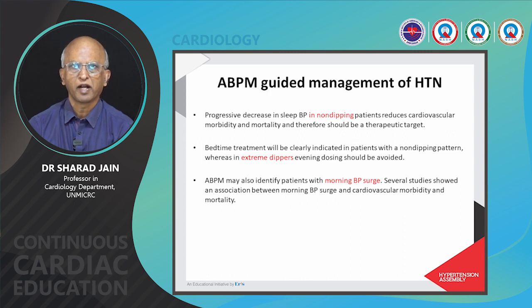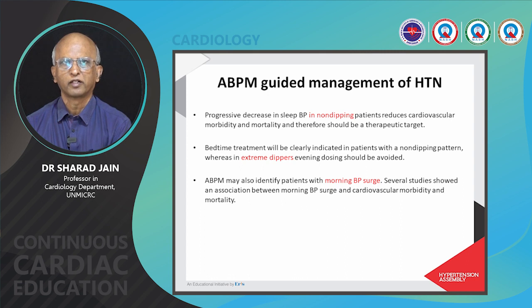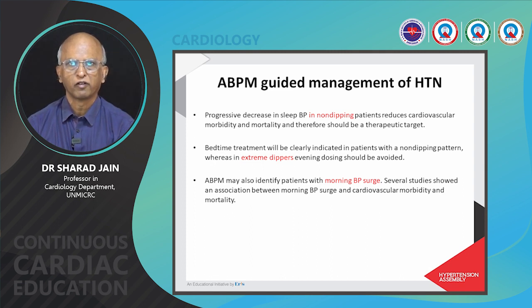So, ABPM guided management of hypertension: a progressive decrease in sleep BP in non-dipper patients reduces cardiovascular morbidity and mortality, and therefore should be a therapeutic target. After starting medication, you can see whether dipping is occurring or not, and you can monitor the therapy according to the dipping. Bedtime treatment is clearly indicated in patients with a non-dipping pattern, that is, you should give a tablet at night when the patient is a non-dipper.